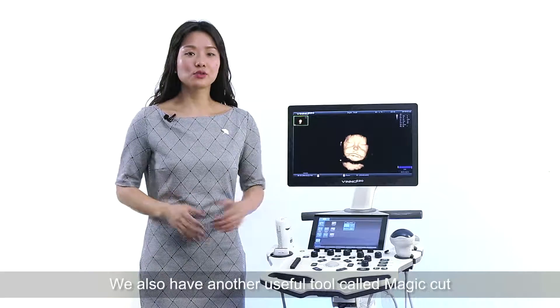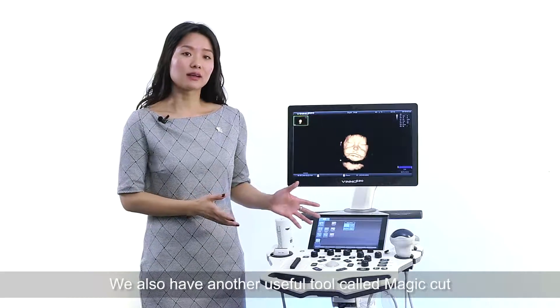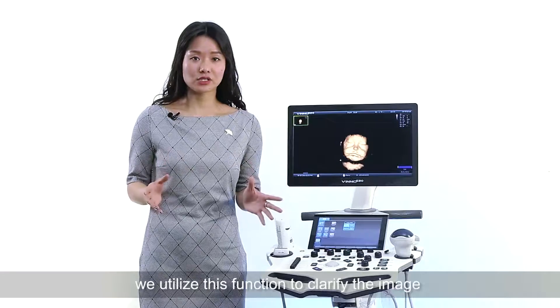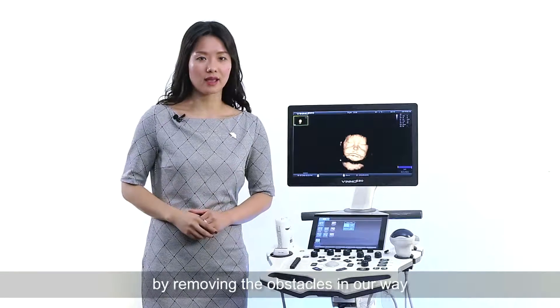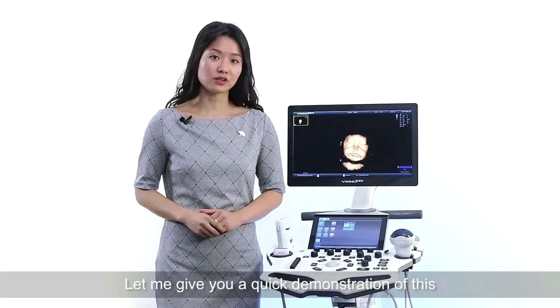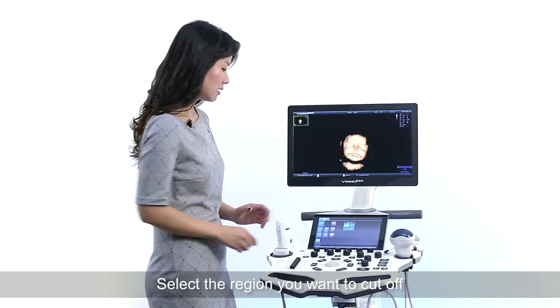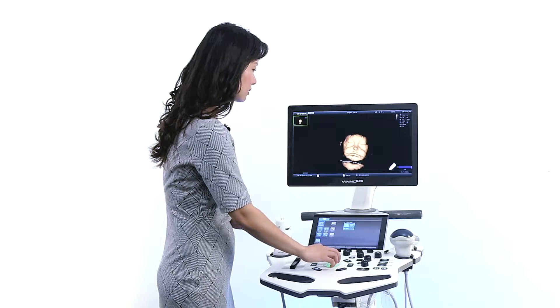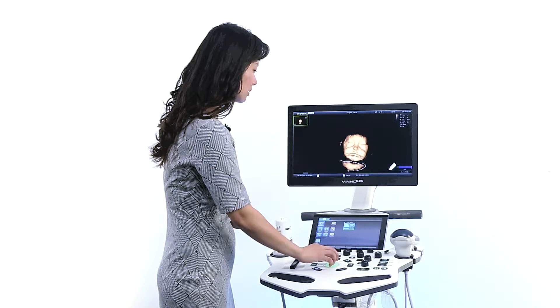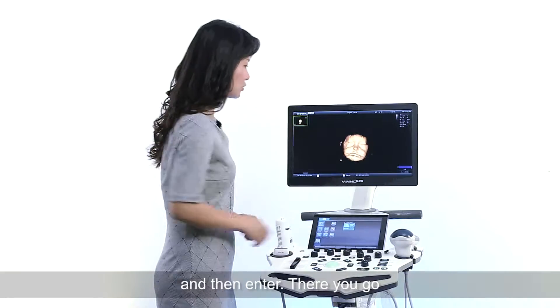We also have another useful tool called Magic Cut. We utilize this application to clarify the image by removing the obstacles in our way. Let me give you a quick demonstration of this. Select the region you want to cut off, and then enter. There you go.